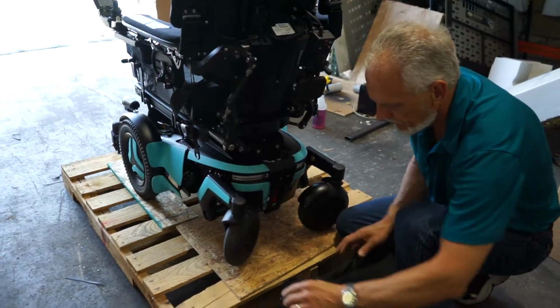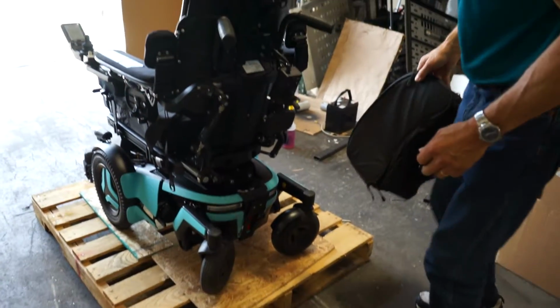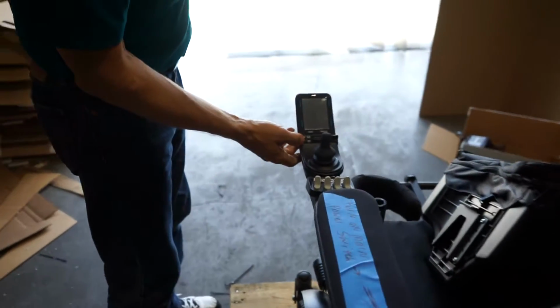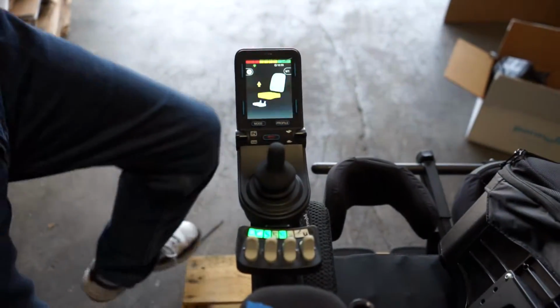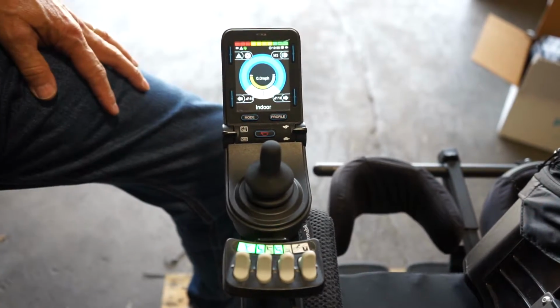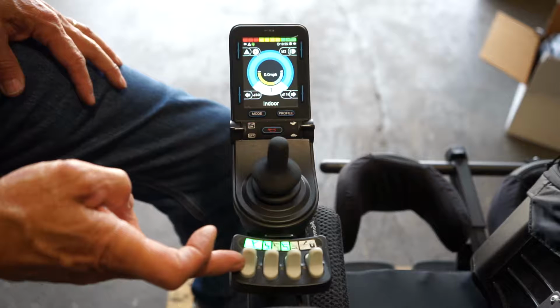So the part is now on the joystick. Just the one little thing on the joystick I'm going to show you. If you come here on the joystick, I'm going to turn it on, okay? So now we're on. I'm going to put it back. So this is speed number 1 over here. You can do all the functions of the chair through these buttons also, okay?